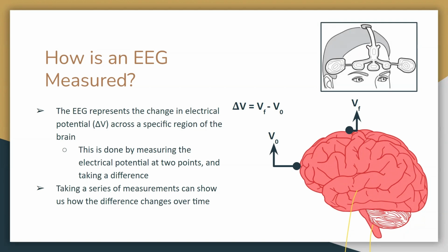I have something to add. If you watch EEG techs do a full head with gold cup electrodes, they'll use an abrasive soap and actually exfoliate the skin, then use a hyperconductive gel to reduce the impedance. Anything below 10 kiloohms tends to work well. Yeah, this gets complicated because in reality it's not water, but water and electrolytes, so that calculus might be different.